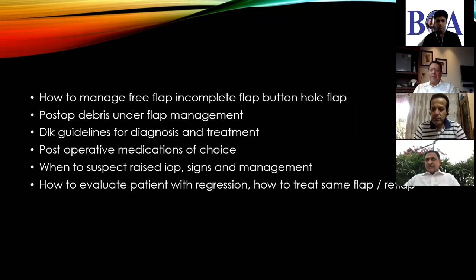You're not going to make another groove. The way to get around this is to do the case 15 minutes later, when that suction groove has gone away. Otherwise, you're going to go back.